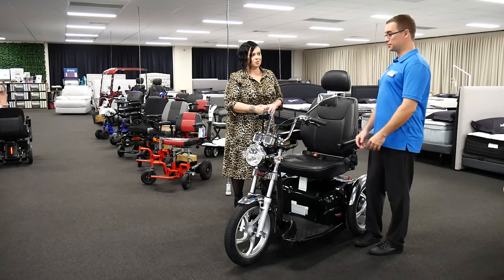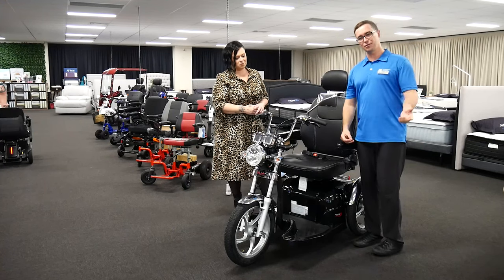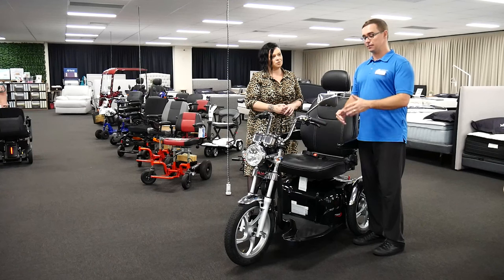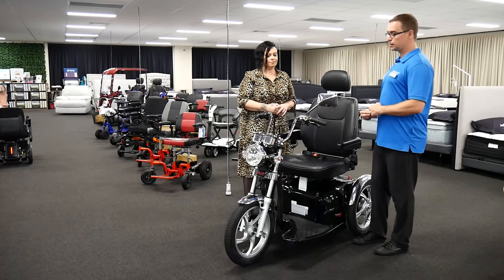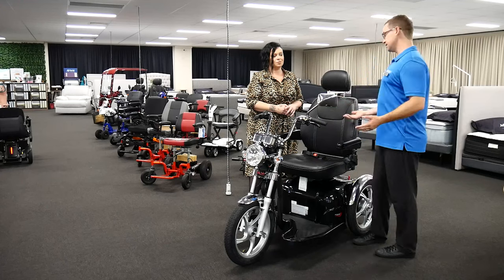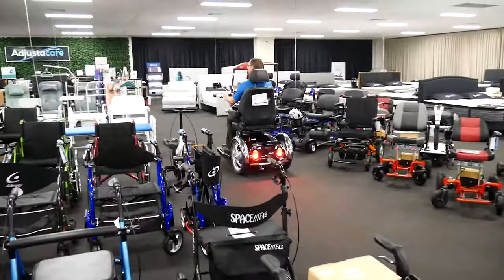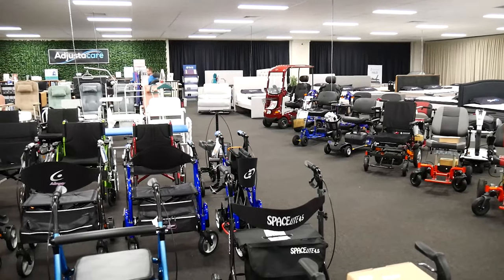Sometimes people will feel really comfortable straight away — they've driven motorbikes, golf carts, and all sorts of things in their life and there are no problems. Other times, this may be the first time anyone has ever operated a piece of motored equipment in their life and it can be quite confronting. The important thing is we take that time to train, and a good thing here at Adjustacare is we've got a lot of space — we can decrease the speed while training, navigate around lots of different pieces of equipment in the store, and take our time to build that confidence.